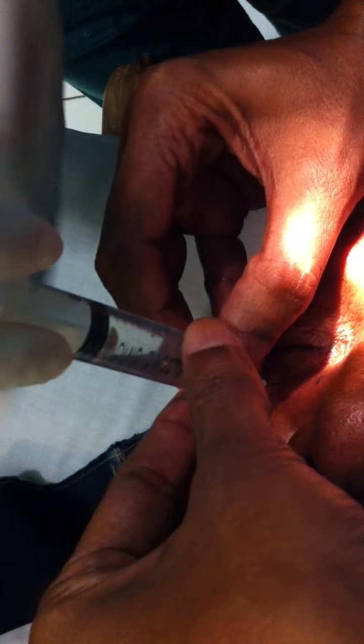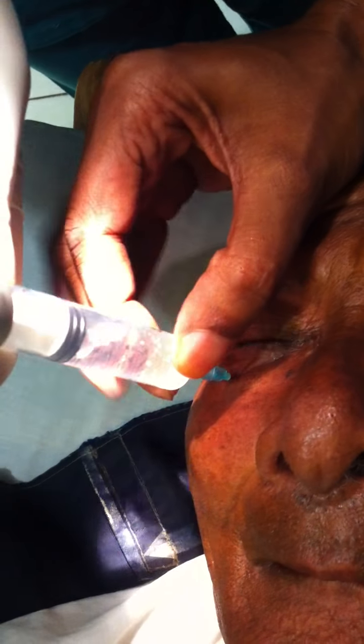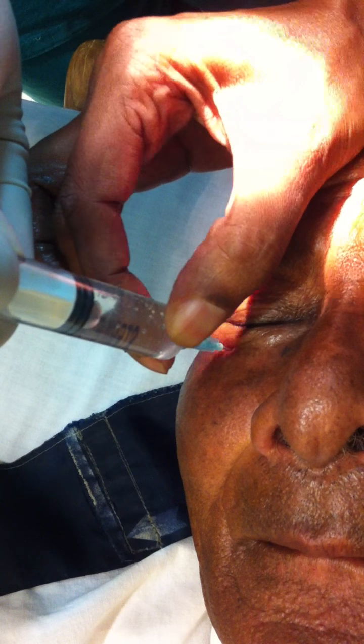Okay, good — draw back, is there any blood? No. How much? Half. Once you see — give half. See, the globe is becoming prominent. Stop.